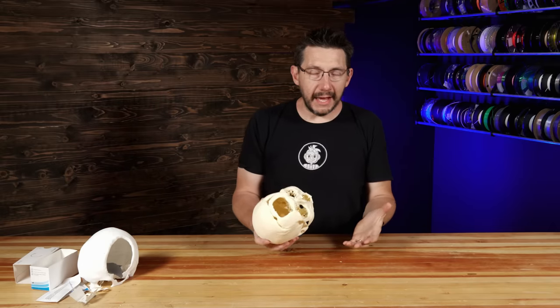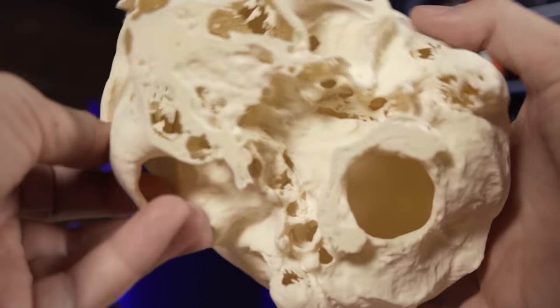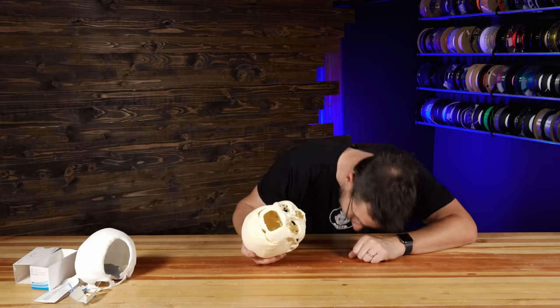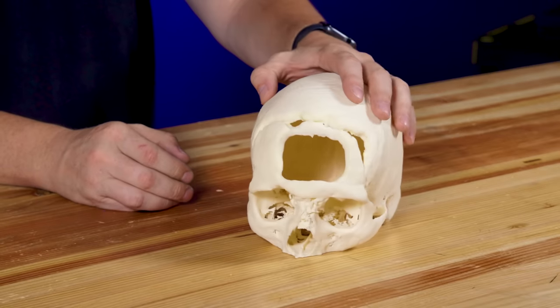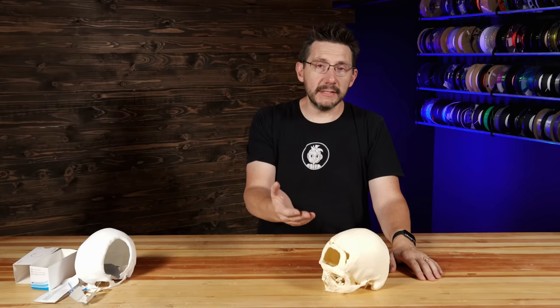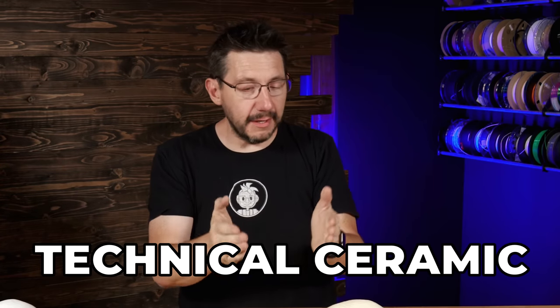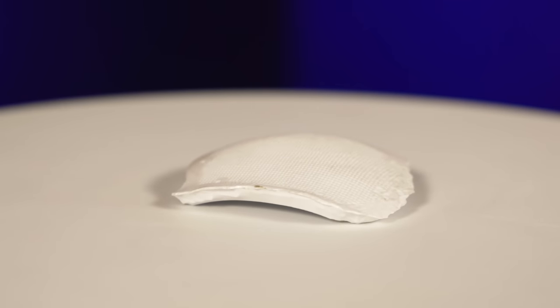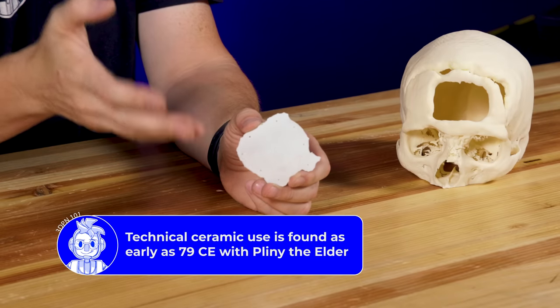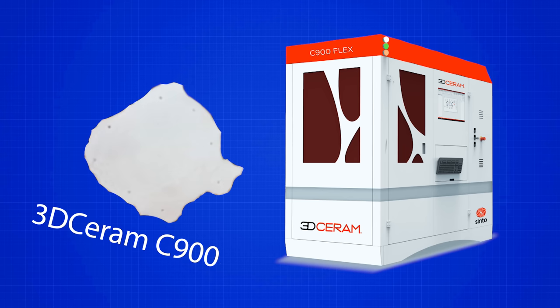Let me show you what the new hotness is. I hold in my hands, yet again, another human skull — this one, of course, 3D printed, just like the last one. This one's slightly off color; it must have been exposed to the sun longer. This one also has a defect, whether congenital or from trauma. However, now we have the option of a technical ceramic to put in place. This is a HAP ceramic — hydroxyapatite — printed on a 3DCeram C900.